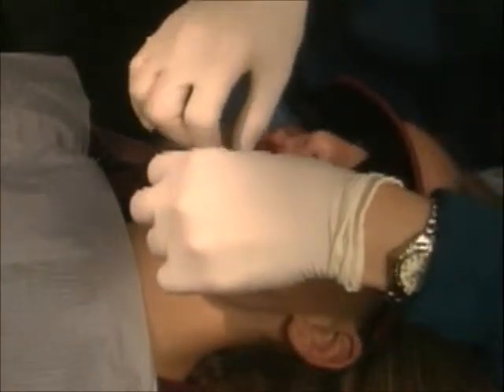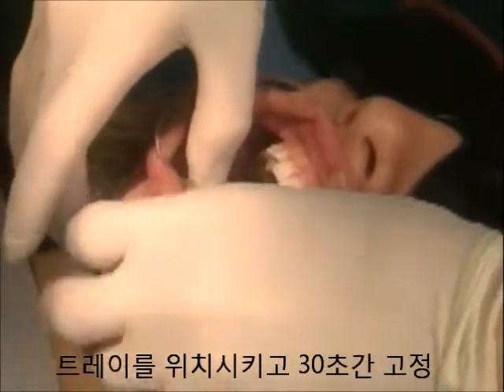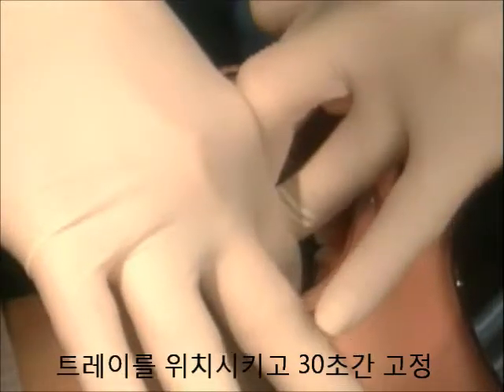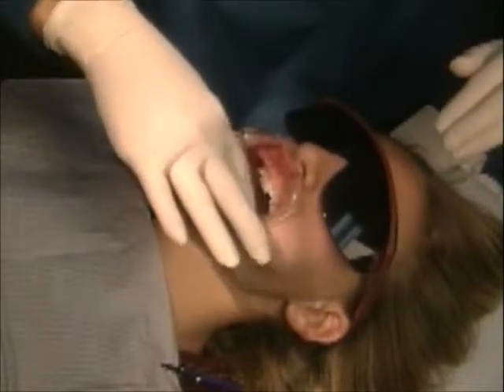Seat the lower tray with a hinge motion. Note the firm pressure occlusally, labially, and buccally to avoid tray rotation. Hold the segment firmly for a minimum of 30 seconds using a timer. The tray must sit for a minimum of 2 minutes prior to removal.